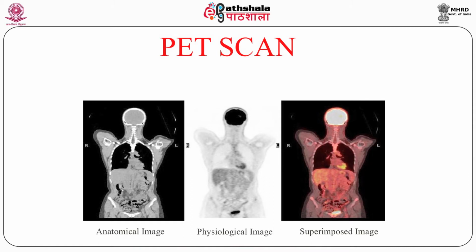Now, the first image is what is found as an anatomical image. Where has this anatomical image come from? It has come from the CT part.